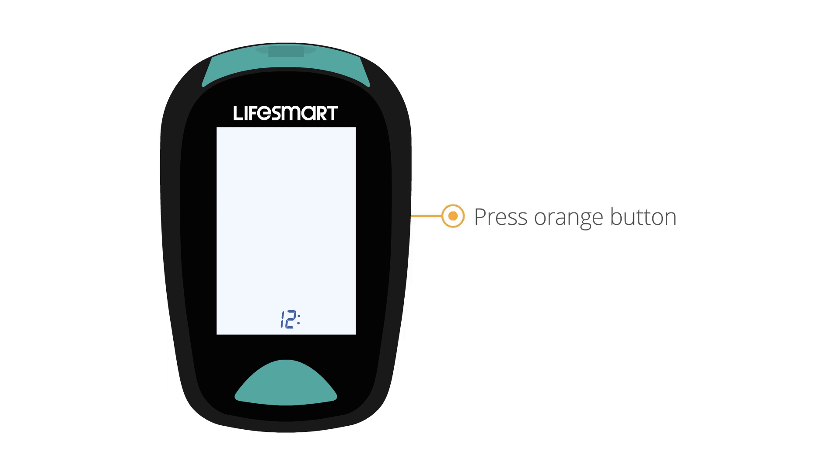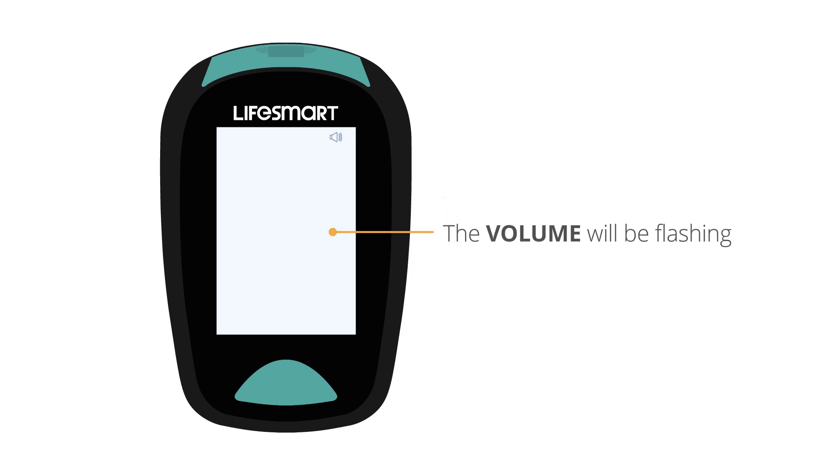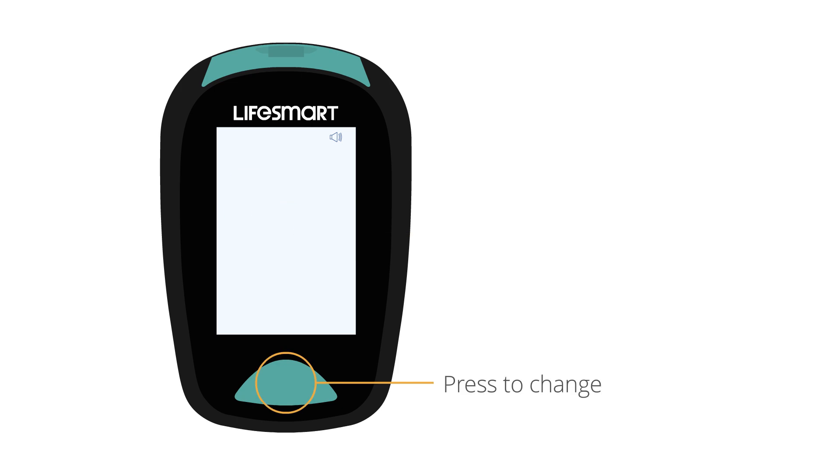Press the orange button again. The volume will be flashing. Press the green button to change.